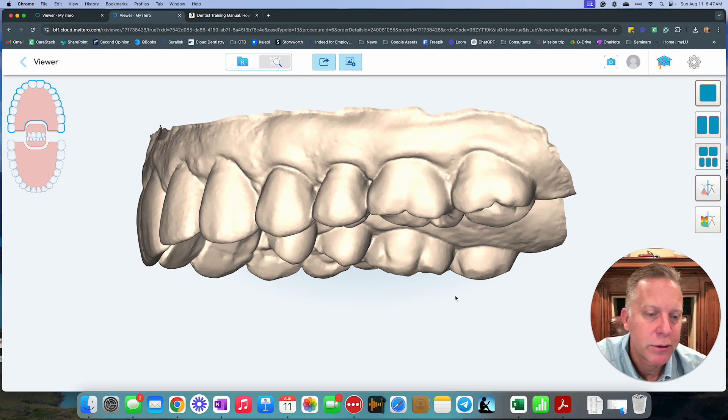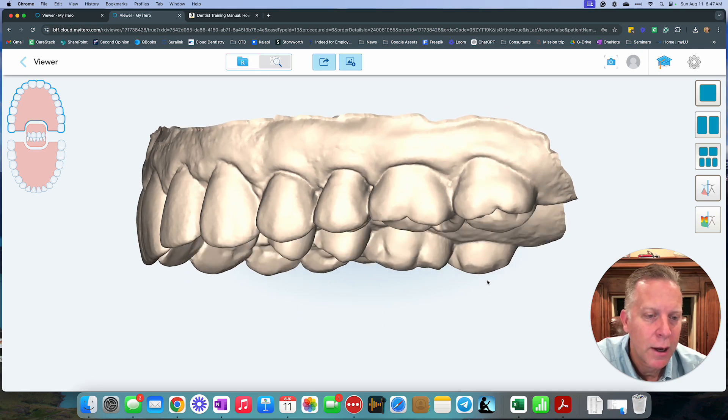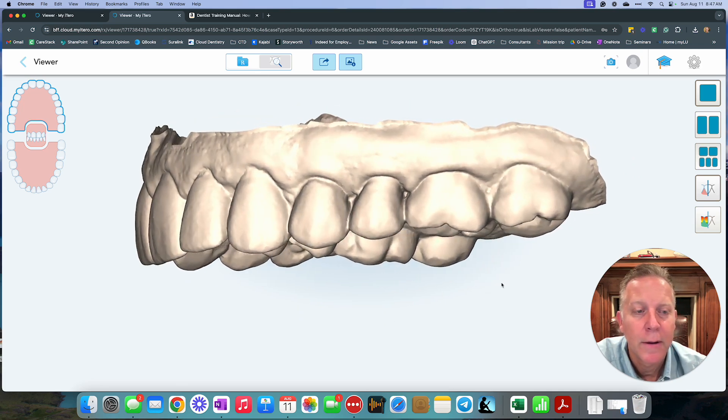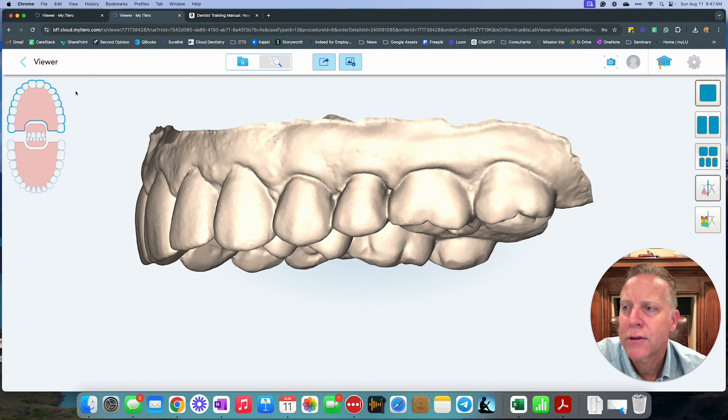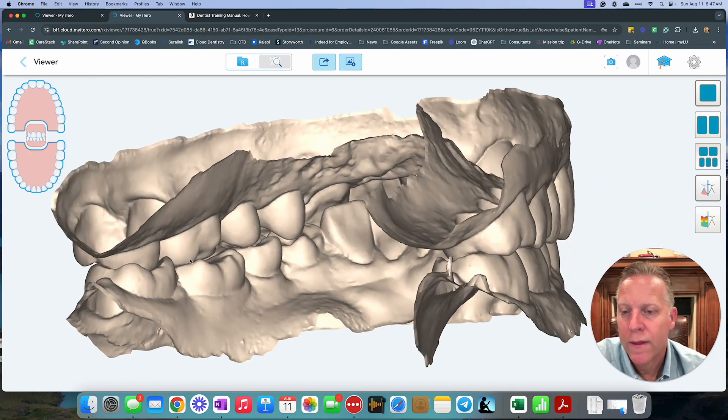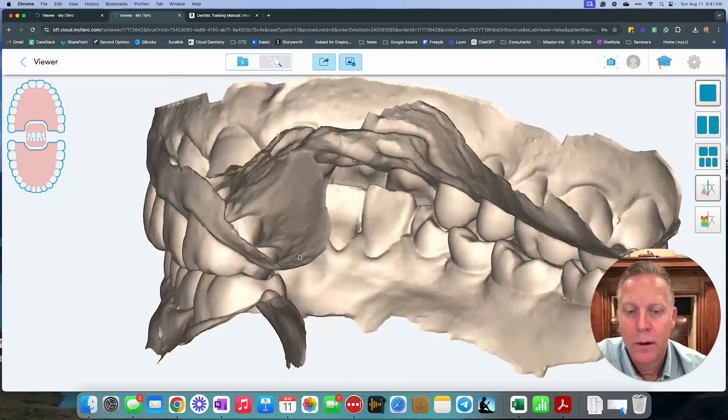Both of those have been reduced. Here's that second molar on the other side, and here it is on the left. And now let's go take a look. If you want to see how they come together, how much difference does this make with the occlusion?